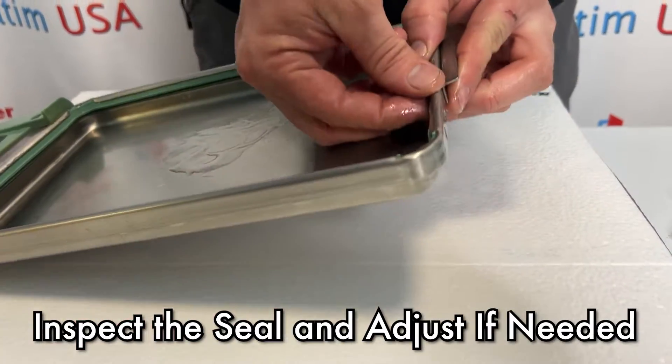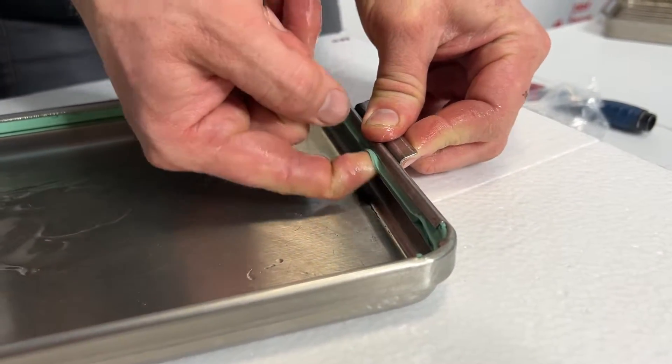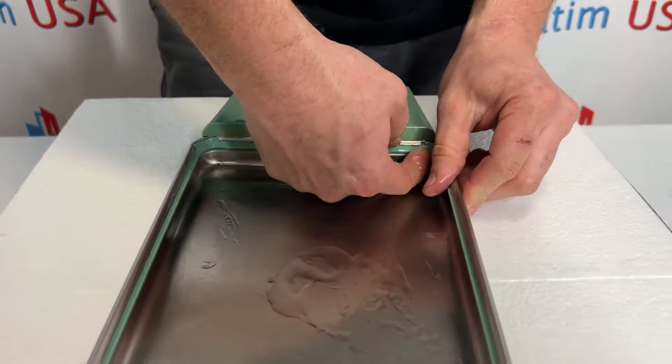So I'm going to take a finger and put it between the grooves of the seal, pressing up and in. I'm just going to slide my finger all the way around this cassette seal. This will help set the seal.